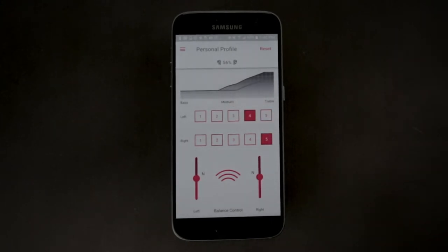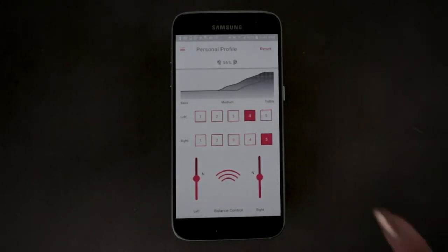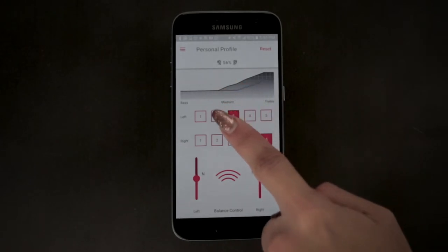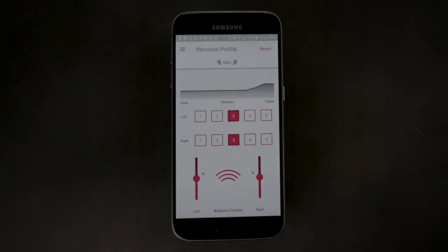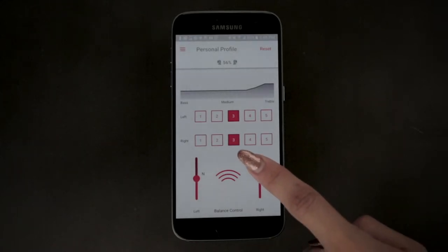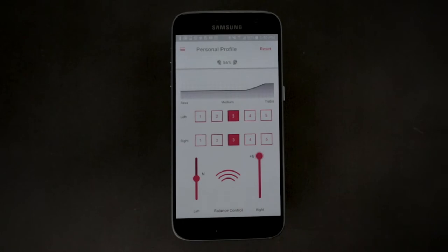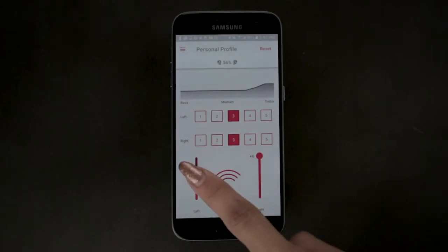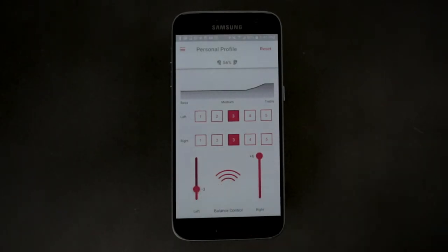You can use the balance control at the bottom of the screen to adjust how you hear both the sounds in the world around you as well as the audio from your Bluetooth device. If you are aware that one ear hears better than the other, set the balance control for the worst ear to the maximum setting, then adjust the balance control for the better ear so that the sound to each ear appears symmetrical.